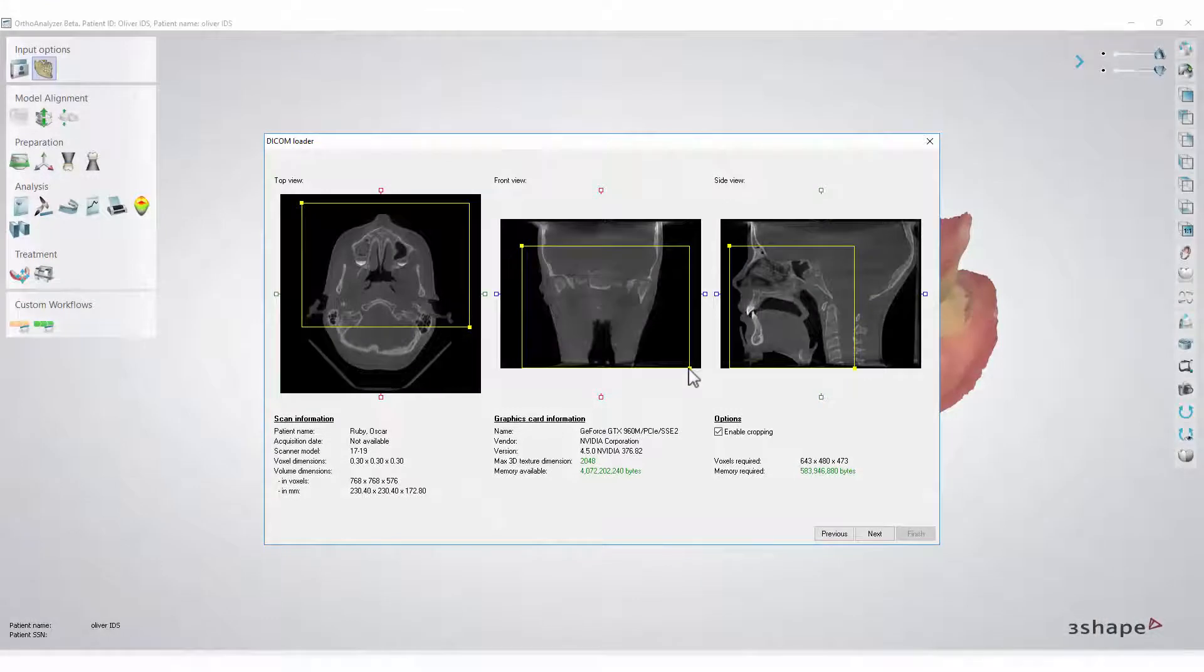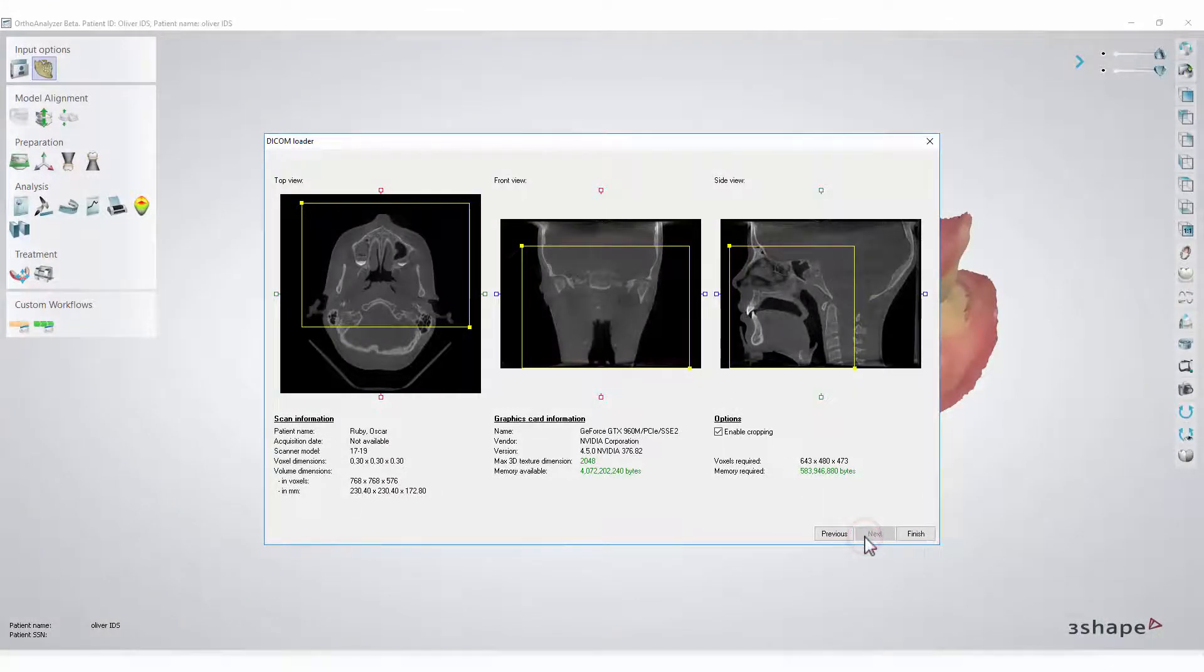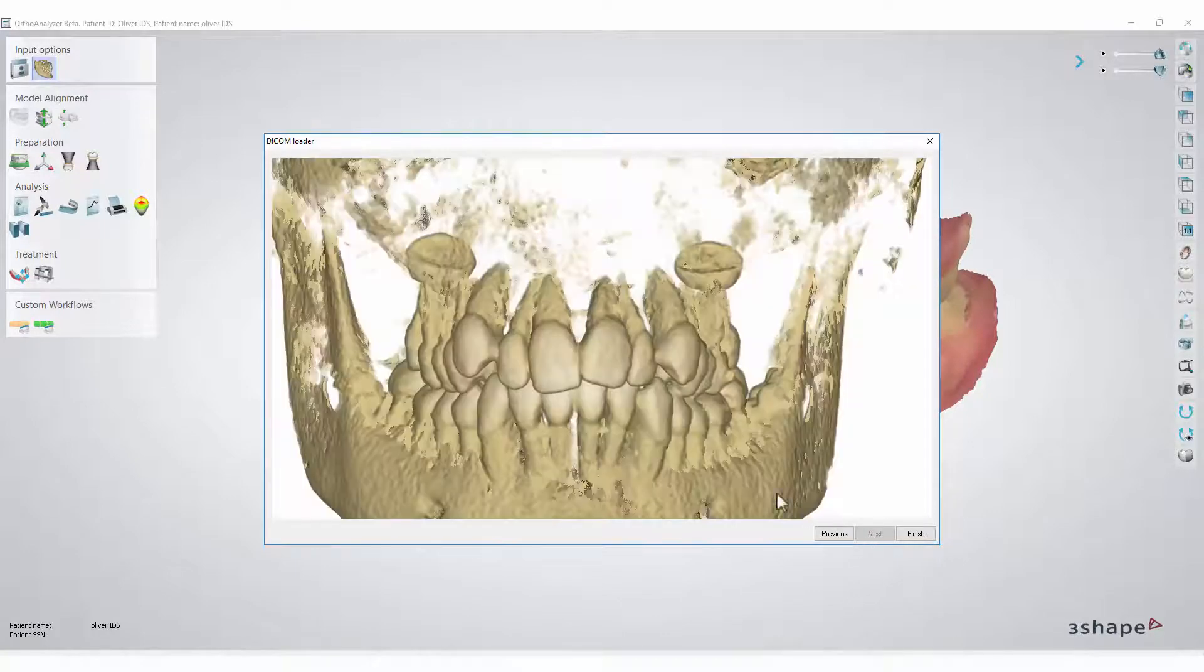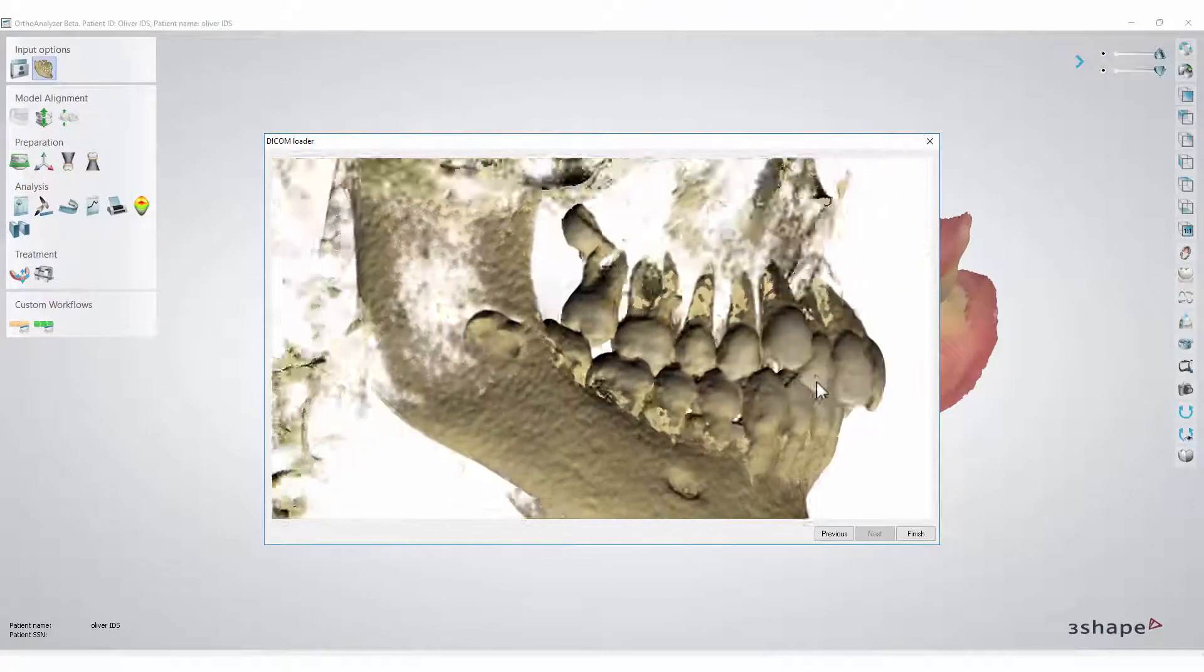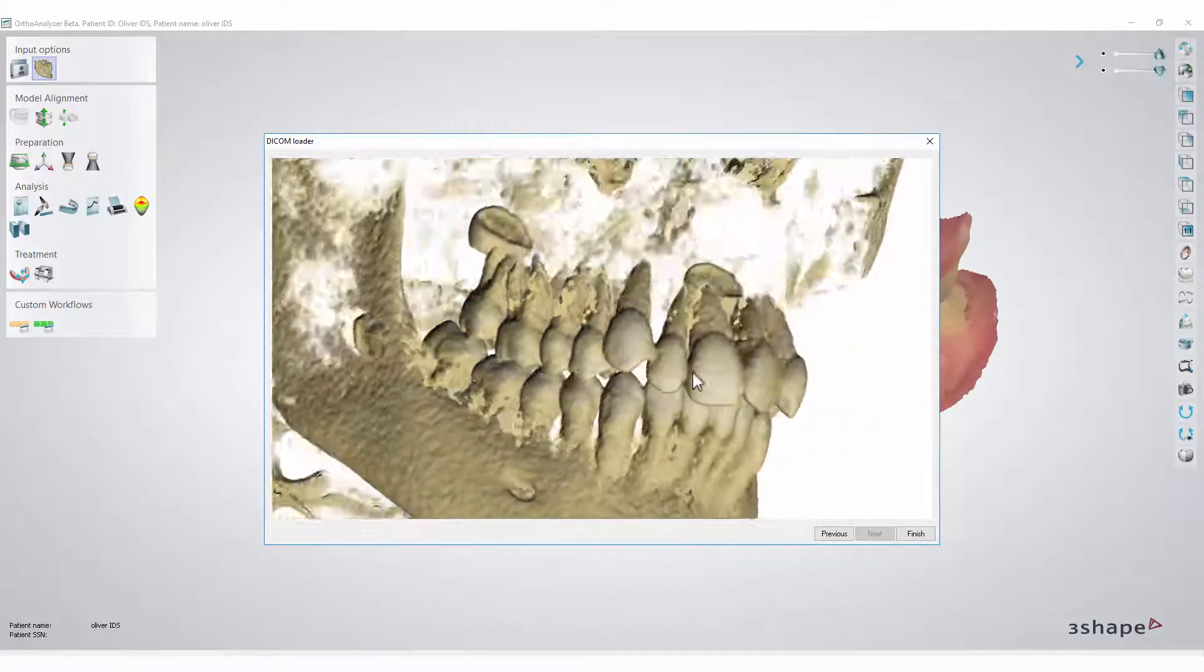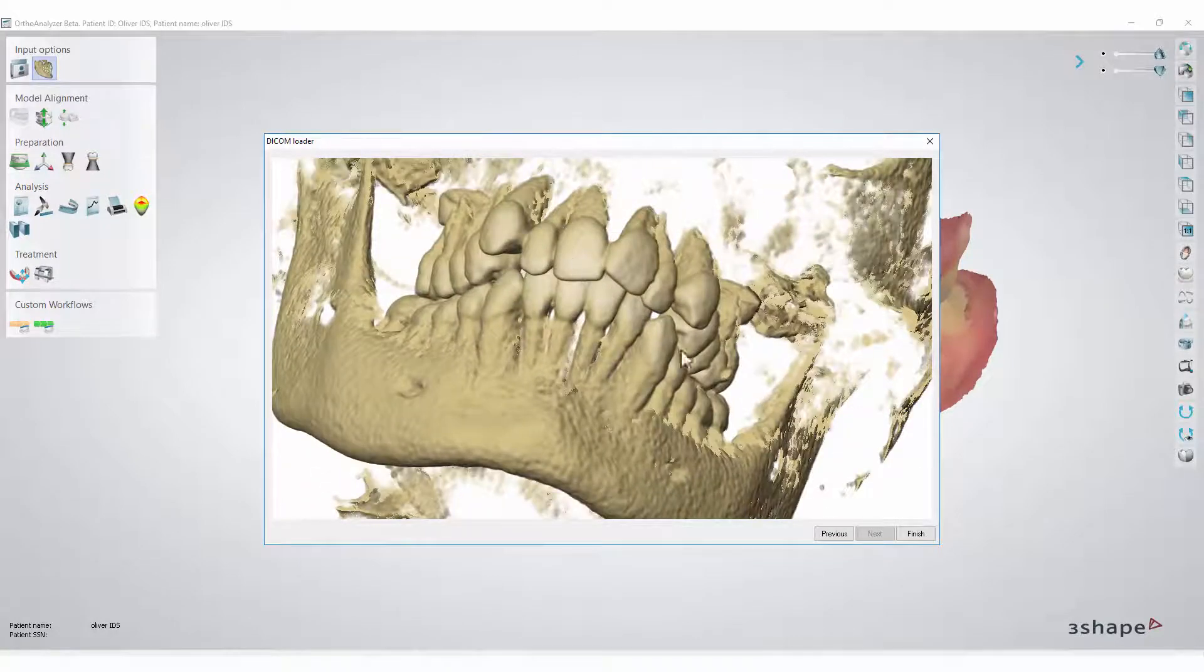Once you are satisfied with the amount of X-ray you want to import, click Next. A small preview will appear. See if you have everything that you need and click the Finish button.